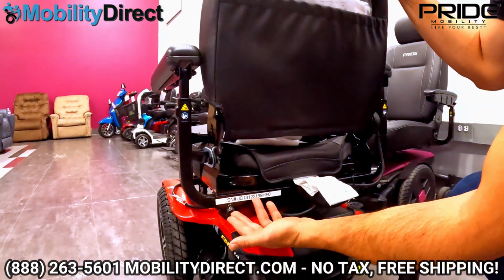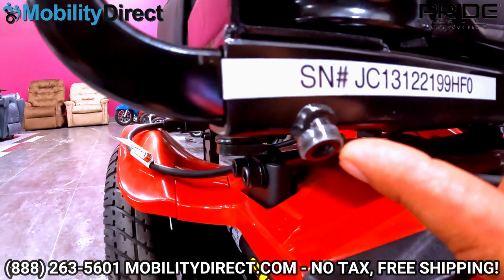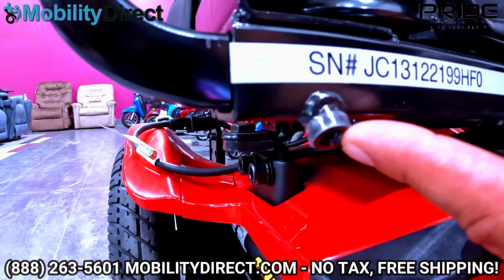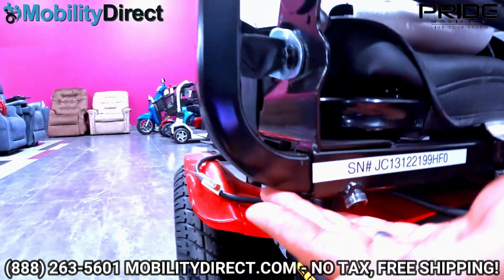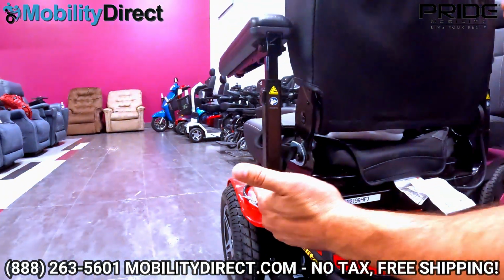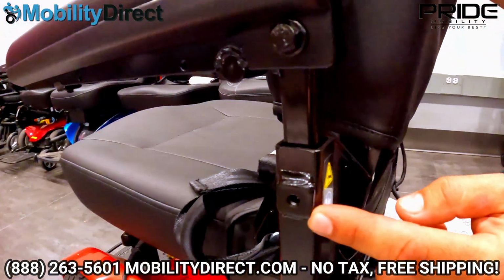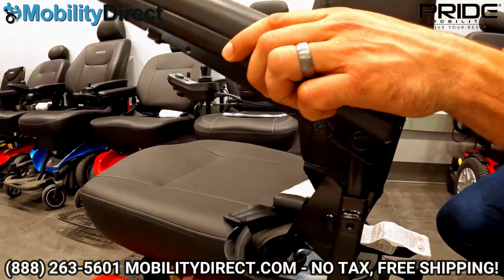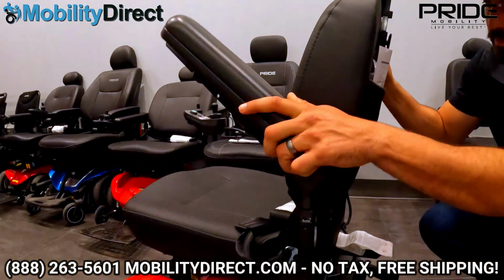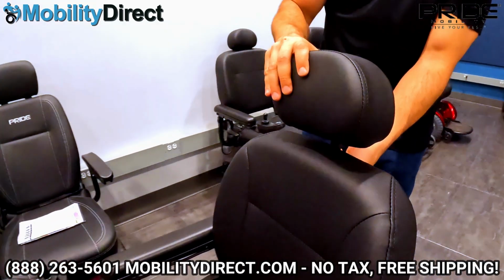Now the armrests are width adjustable. Where I'm pointing right here, you can't really see it, but there's a set screw. You'll use the Allen key that comes with your model in the user manual bag to loosen that set screw, and then you can bring the armrests outwards to create more distance between the armrests. So they're width adjustable, and there's another set screw here to adjust the height of the armrests as well. By the way, the armrests do flip up, and it has a headrest which is also height adjustable.